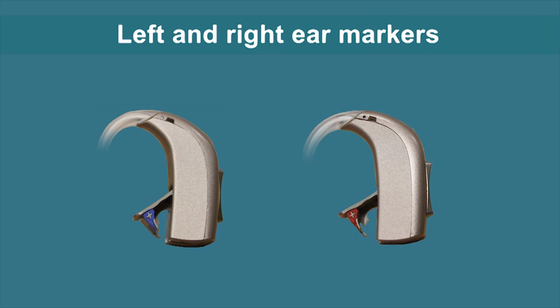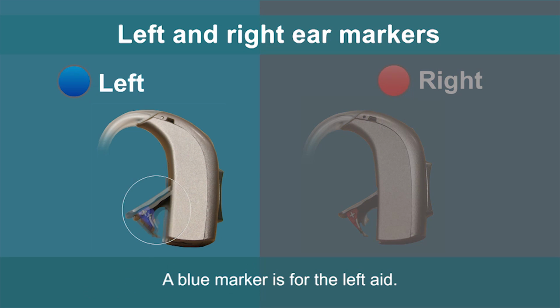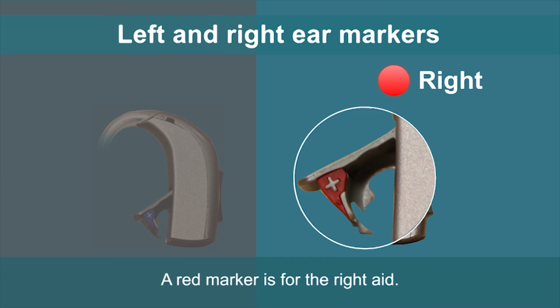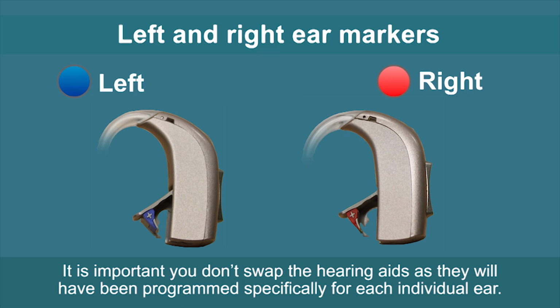Left and right ear markers. Depending on your hearing loss, you may have a hearing aid for one or both ears. If you have two, the audiologist may have identified the hearing aids with left and right markers. A blue marker is for the left aid. A red marker is for the right aid. It may be helpful to think of R for red and R for right. It is important that you don't swap the hearing aids, as they will have been programmed specifically for each individual ear.